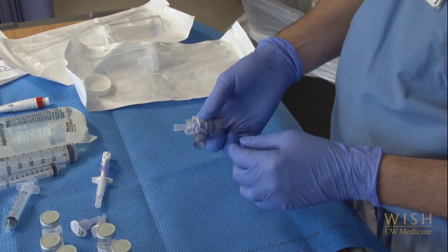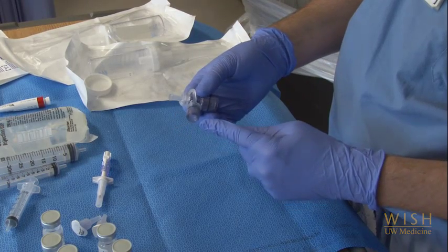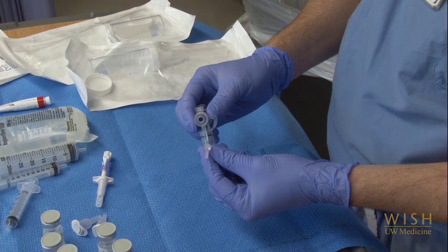This plastic device is called a swivel. It allows you to perform bronchoscopy through the endotracheal tube. You will break the circuit between the tube and the ventilator. This end of the swivel attaches to the endotracheal tube, and this end attaches to the ventilator tubing. This flange can open and allow you to insert your bronchoscope through the swivel and down into the endotracheal tube, maintaining air flow between the ventilator and the endotracheal tube. You'll see this in action in the later bronchoalveolar lavage video.